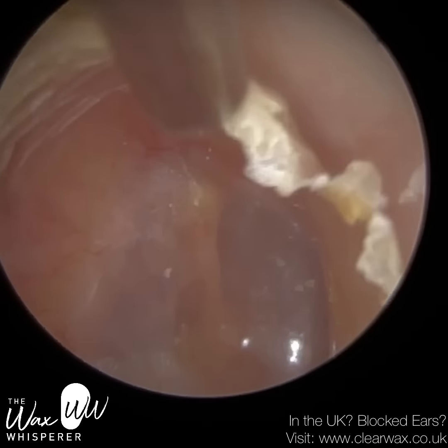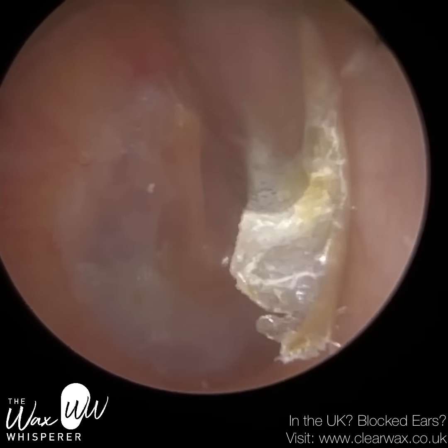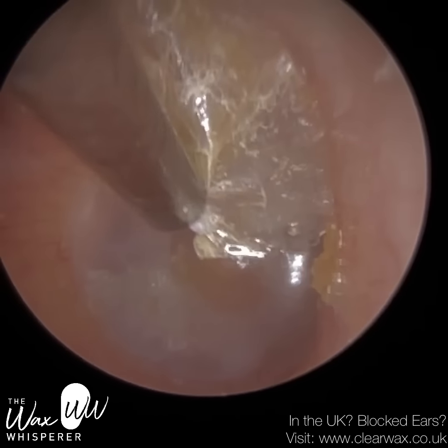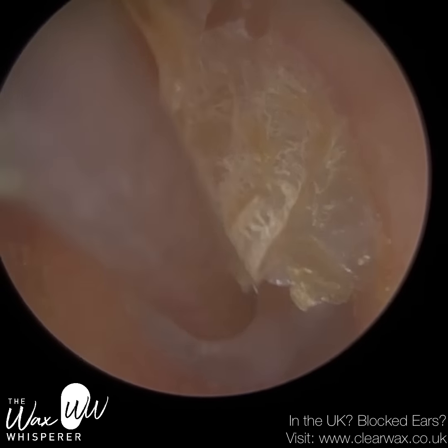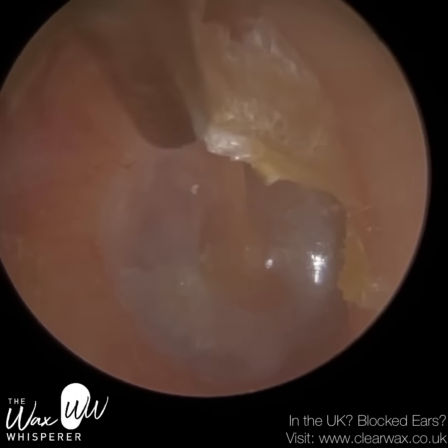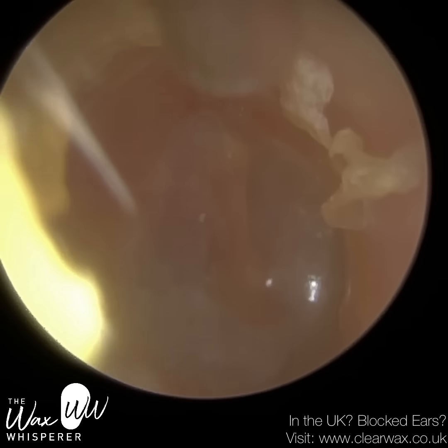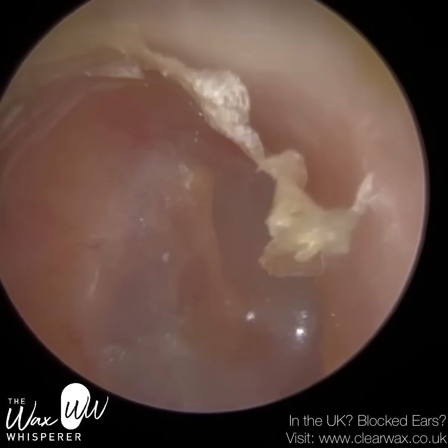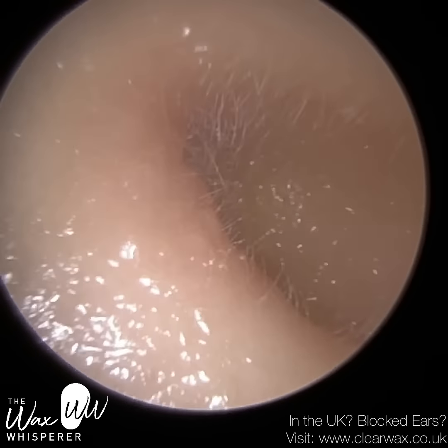And you can see this technique I'm using. I'm just slowly but surely trying to loosen it. And again, you just want to find a weak spot sometimes with the skin. And obviously we're approaching the eardrum now. I'm just peeling downwards. So I've just come out. I'm going to go back with a different line of attack. There's just some debris at the entrance, so I'll remove that first.